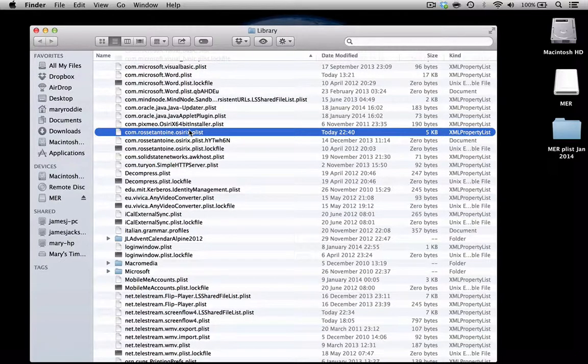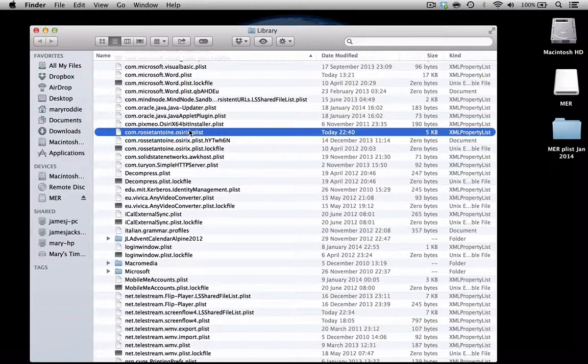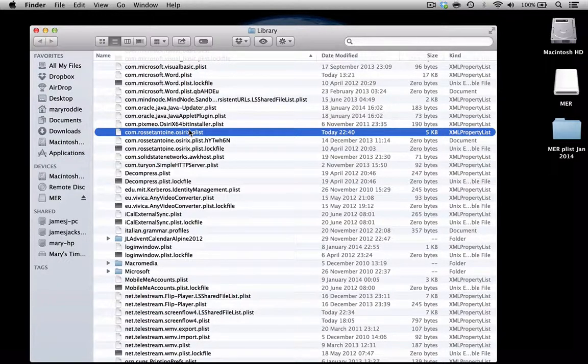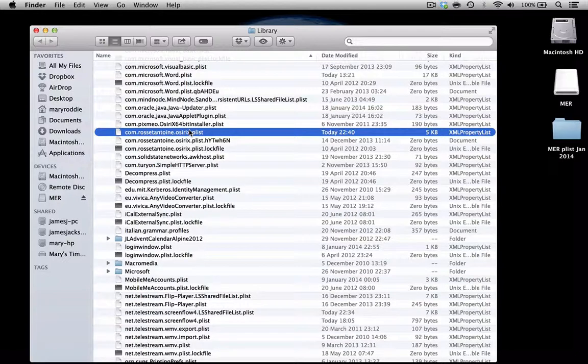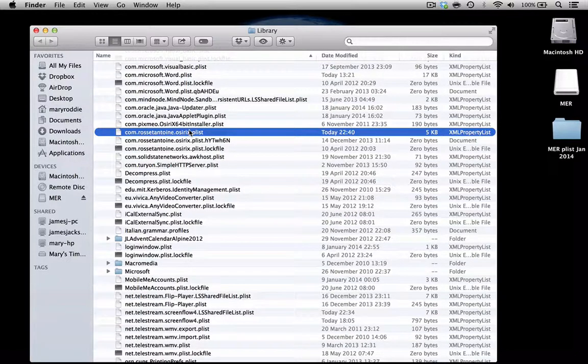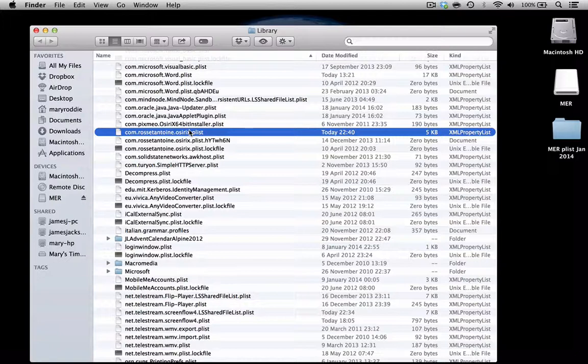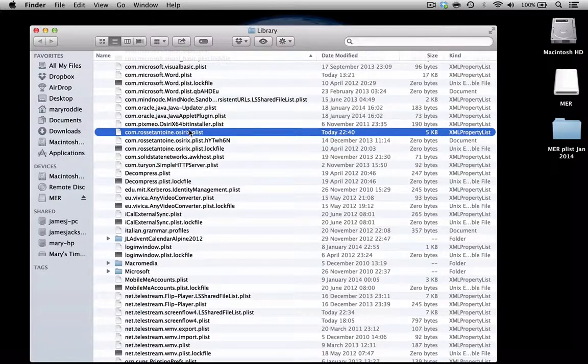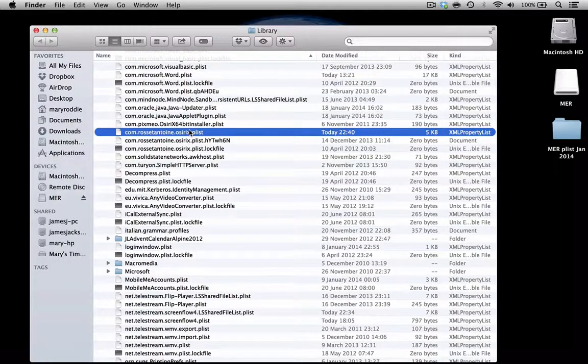If you copy this file that has all your preferences stored on it and go to another Macintosh computer and paste your PLIST file into the Preferences folder in the Library, when you open up OSirX it should work in exactly the way you want it to.